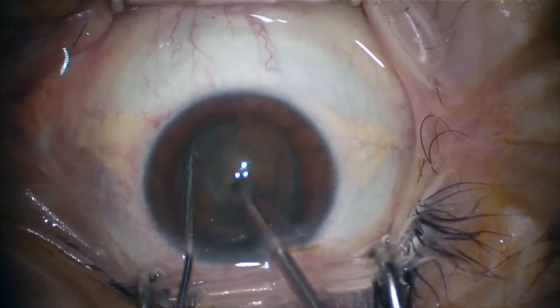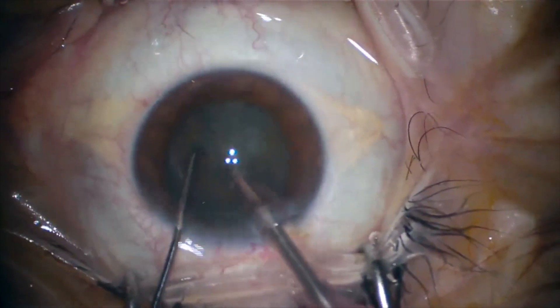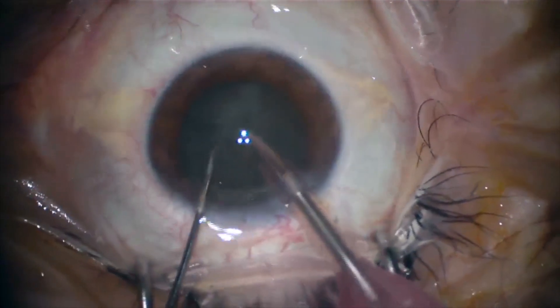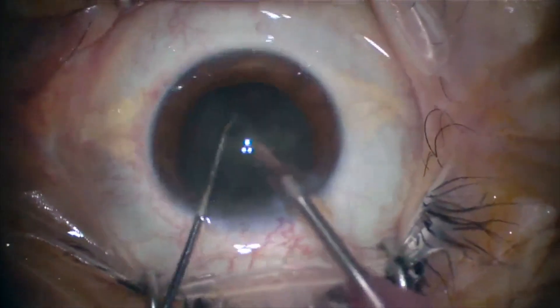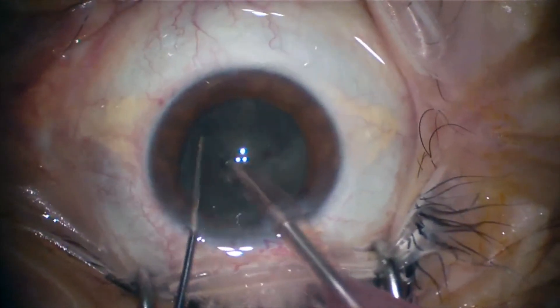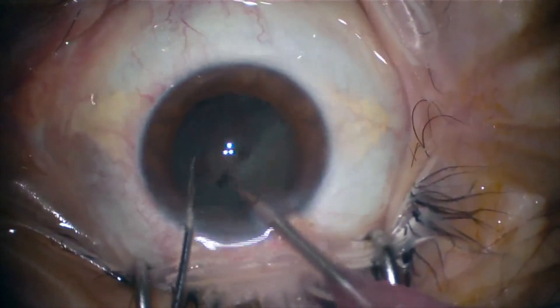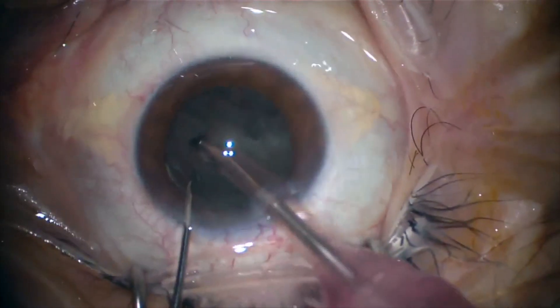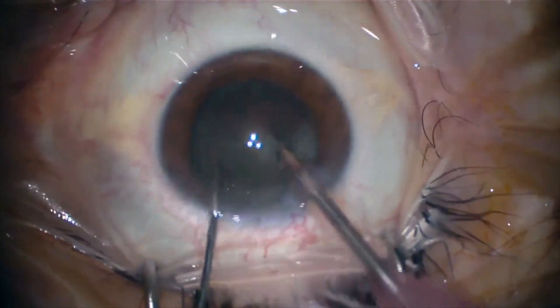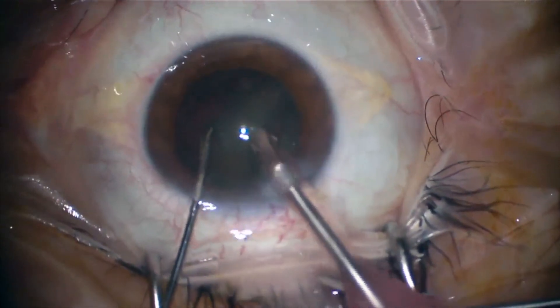I am pretty convinced that all cataracts can be chopped. My favorite chopper is the Katena Dewey angled chopper, and we are doing a horizontal chop at this time. One of the most important tips in phacoemulsification is not to move the phaco instrument.